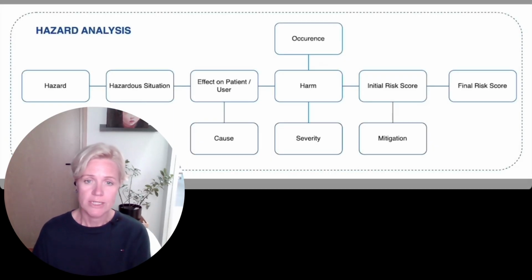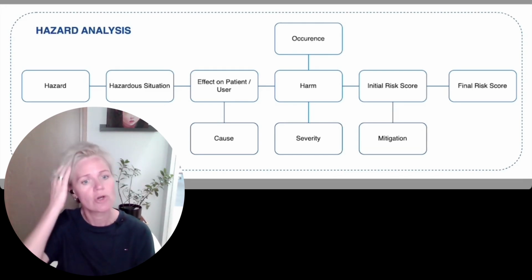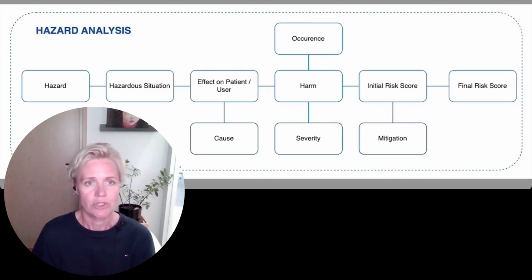Risk management is usually done by following checklists or group brainstorming to list all possible hazards and figure out all those foreseeable events in which hazards could be realized. And a lot of times, of course, you also look at similar devices that are already on market and what type of risks they had. So hazard analysis is a must-have risk management method for your medical device.